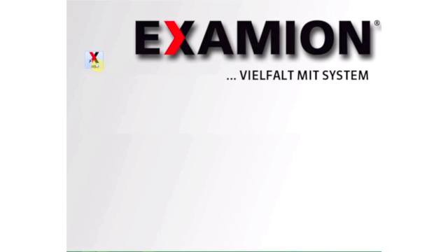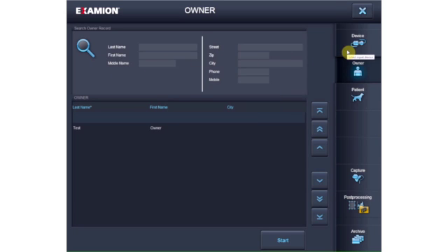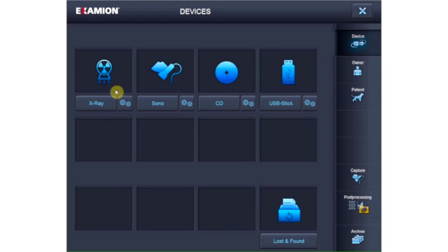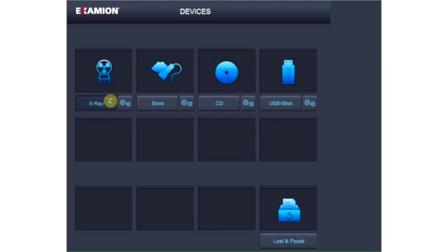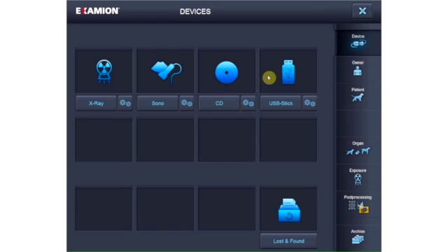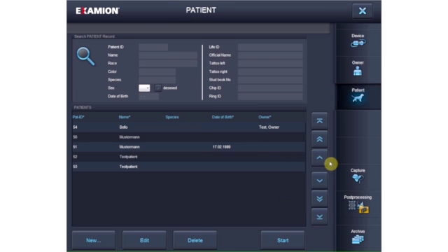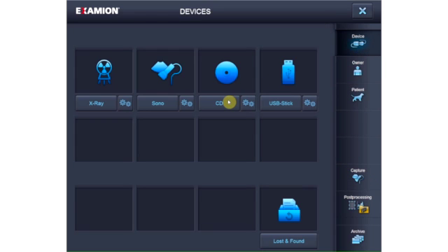Examion AQS software has a variety of modules to work in as needed: the X-ray module, the Sono Video module, the Image Import module, and many others. Changing from one module to another is quick and automatic. The different modules are configured when the software is installed and individually customized for your needs. Each module has its own easy to recognize symbol.